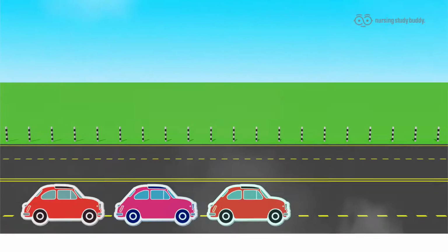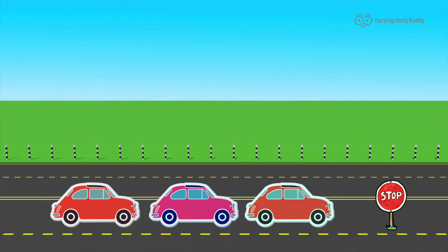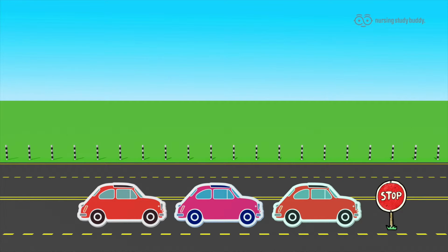Now that we've gotten both of the second degrees and the first degree out of the way, let's get into the worst of them all, the third degree. The third degree block has a complete disconnect between the SA and the AV node. This roadblock, in our analogy, is blocking anything from going through, so that cars cannot get to where they are going, and the heart on the other side is trying to function without that stimulation. This results in the P wave, or the atria, consistently acting of their own accord, completely separate from the QRS complex, or the ventricles, which is also acting in a wide ventricular rhythm completely by itself. The third degree, because of this, is the most detrimental to our patients out of the four blocks.